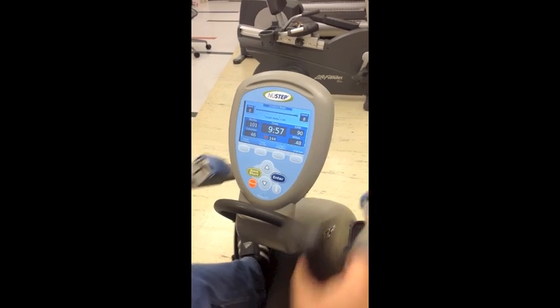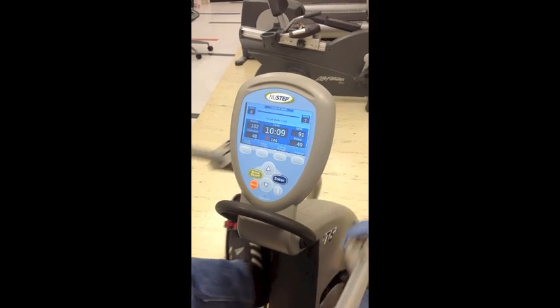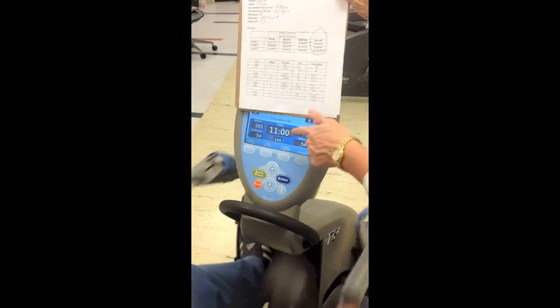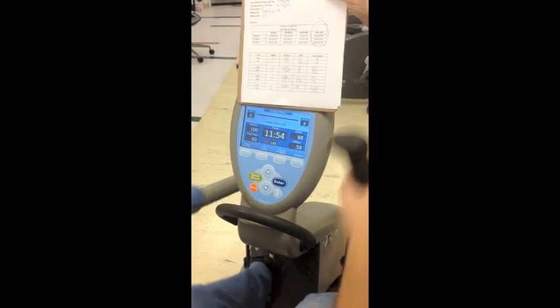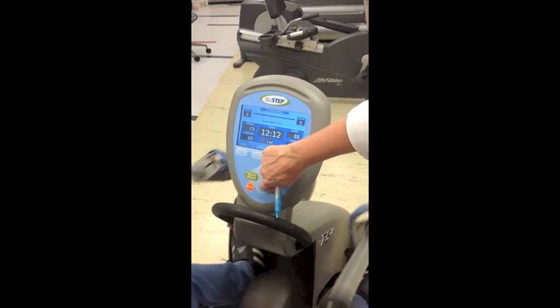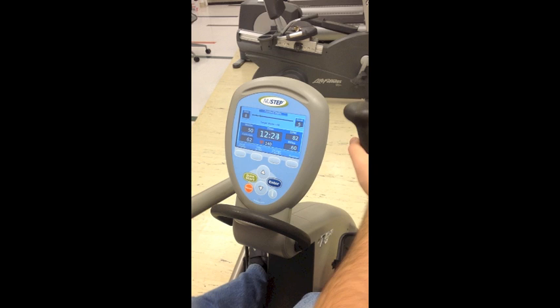Use the up arrow to get to the desired range, and give the participant encouragement on the NuStep. Right before the eleventh minute, record heart rate again. Right before the end of the protocol, check to make sure it is within five beats. If it is, at that twelfth minute use the down arrow so that they can cool down. Select whatever workload is comfortable or appropriate for your participant and let them step at a rate that is comfortable. The goal is to bring the heart rate down. That concludes the NuStep Submax Exercise Test.